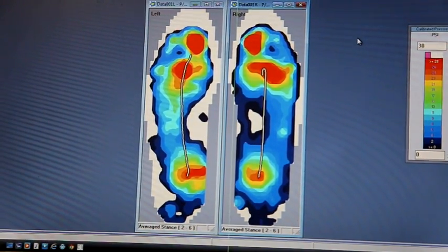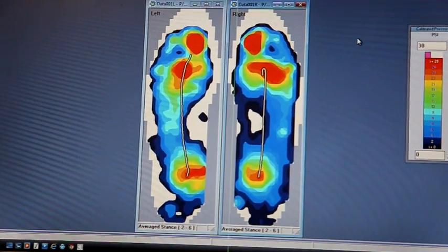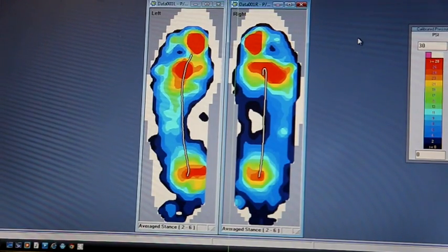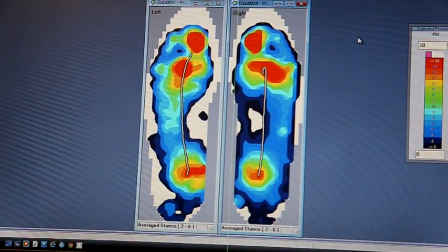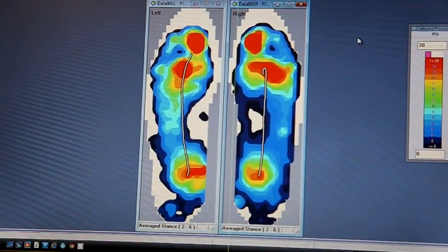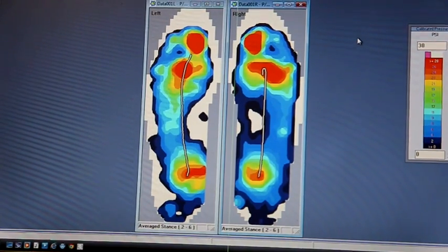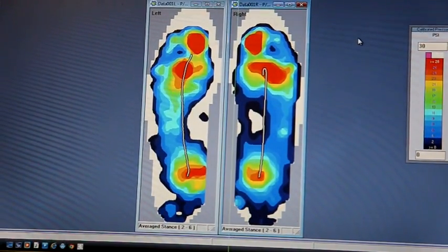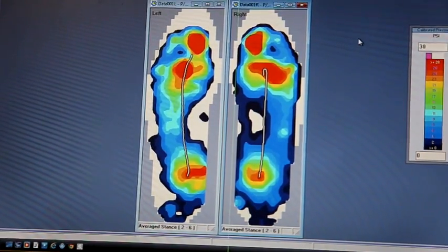This is a very helpful device for us in creating the ultimate shoe. If someone had a center of force to the outside or the inside, we can take that into account and address it with a custom-made orthotic and a specialized shoe as well. So the key here is that we want to make comfort for everyone in the orthotics and in the shoes. And with Dr. D-LuCS, the luxury is in the comfort and the style.